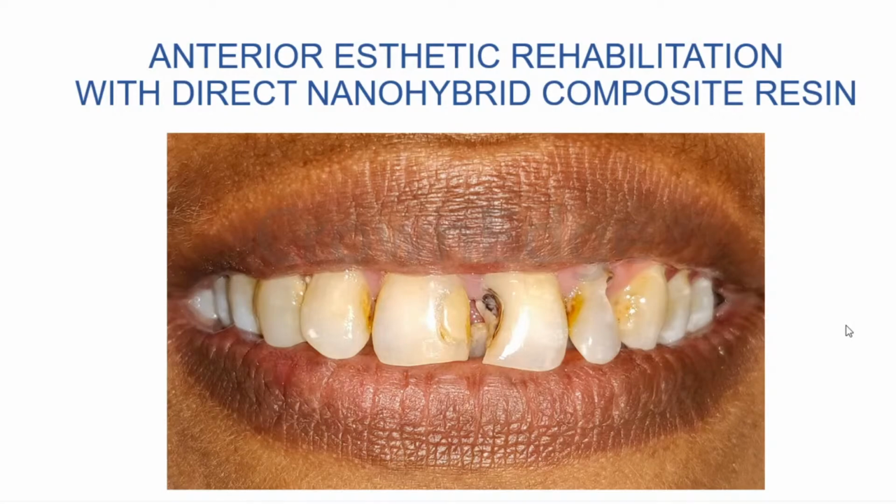You can see that 2-2, the distal half is gone and it's almost till the cervical level, because of which it also had to undergo an endodontic treatment. That is for the lateral incisor in the second quadrant, after which it was restored with direct composite. In this case, we are going to treat right from 1-3 to 2-3 because you can see there's some amount of surface alteration.